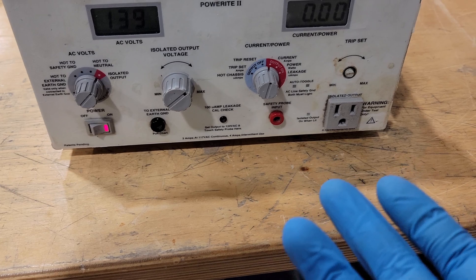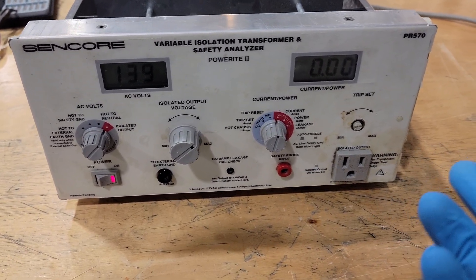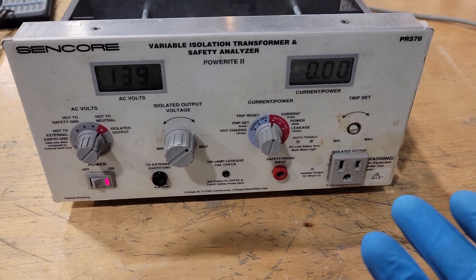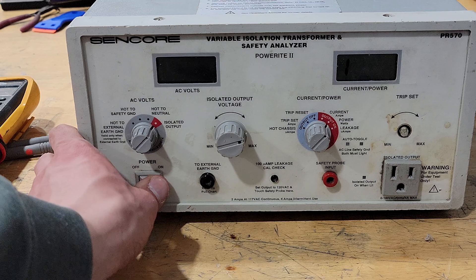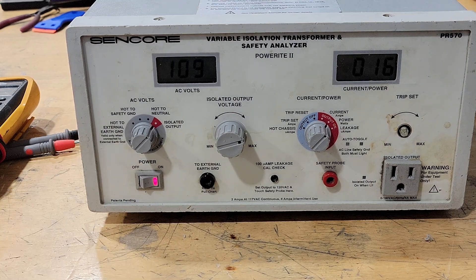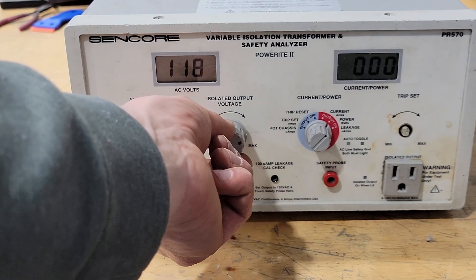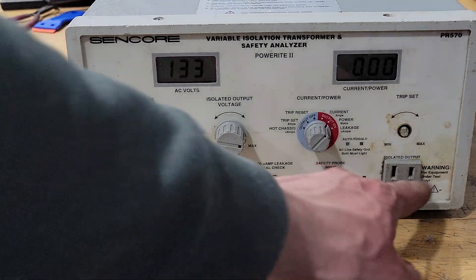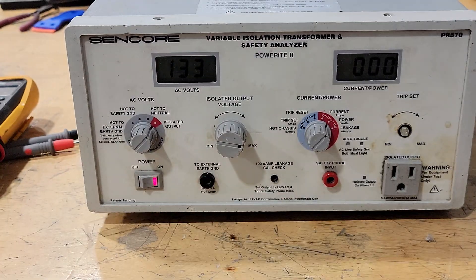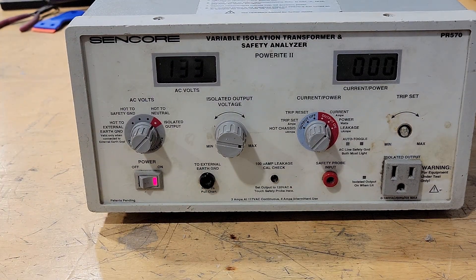I'm going to try putting the case back together. We can test out all of the functions after that and see if there's anything else that needs to be repaired. I did finally get it working. I needed a couple of repairs: one was getting that sweeper blade completely fixed, and another was that the output wires weren't making a very good connection. I had to reseat the connector because they weren't showing an output for a little while.